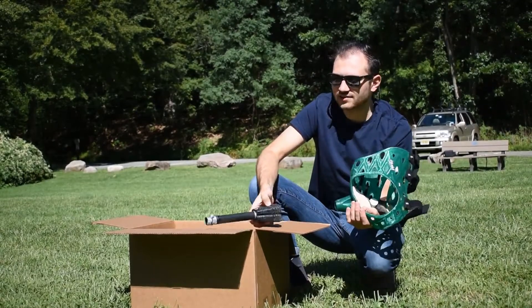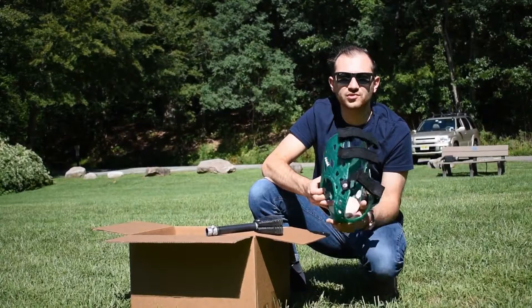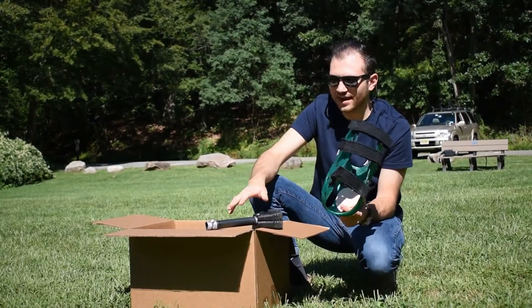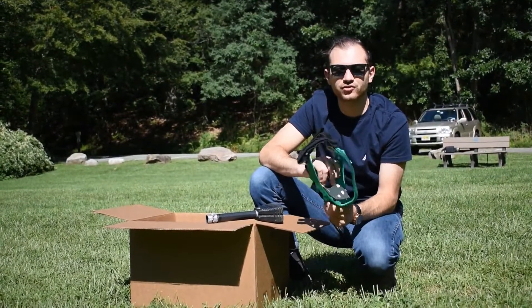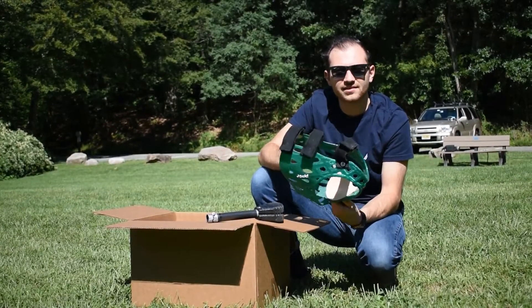Nine times out of ten when you get this, the leg is going to be detached. Sometimes with smaller dogs we will leave it attached. The reason we do this is for larger dogs — we want them to get used to the jacket before we attach the leg. So what we're going to recommend is that your dog wears this jacket for just a few days without putting the leg on.